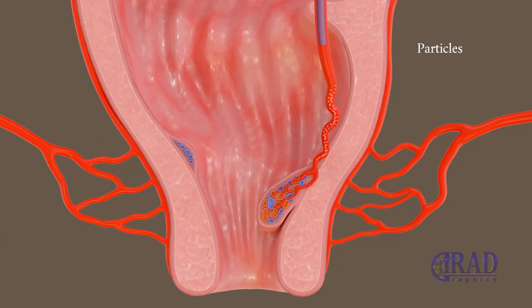Multiple injections of particles may be required. The particle embolization is continued until the blood flow is slowed down and the hemorrhoid space is filled with particles. As the final step, the target artery is proximally embolized using pushable or detachable coils depending on the interventionist's preference to mechanically block the supplying artery.